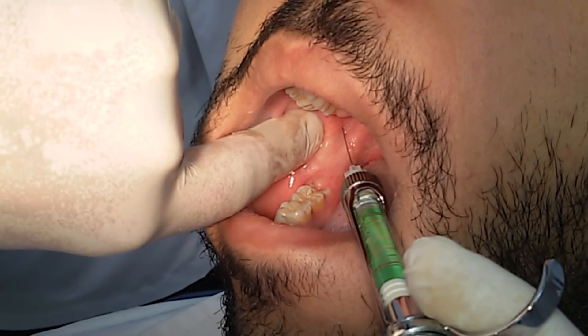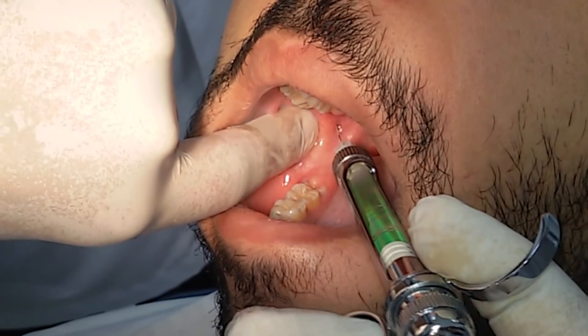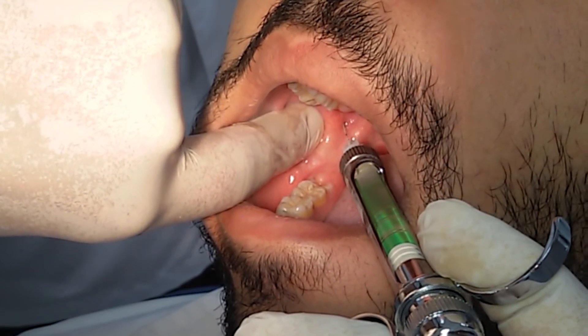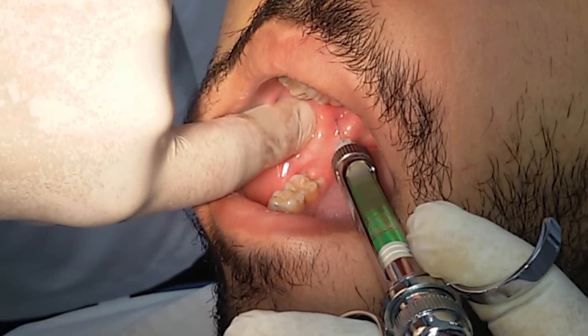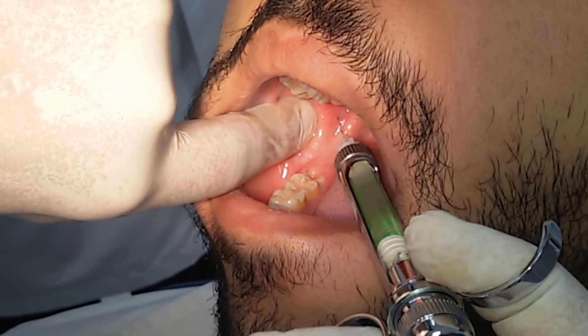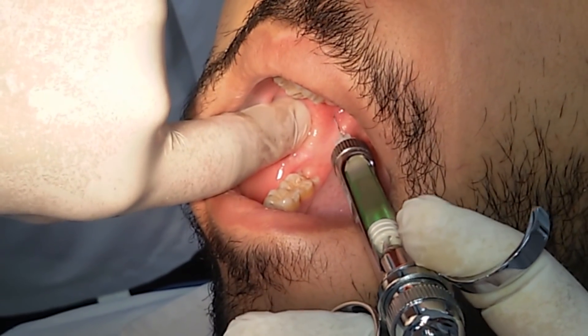Advance your needle through the tissues slowly until you gently touch the bone, which lies on the medial surface of the ramus. You can withdraw the needle one millimeter, aspirate, and slowly deposit about 1.5 milliliters of the solution over about one to two minutes.